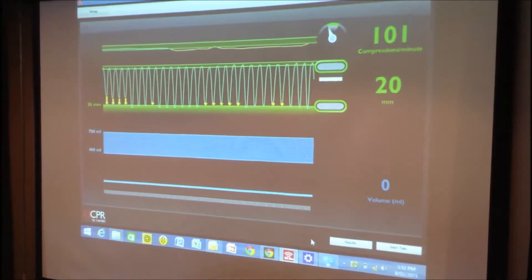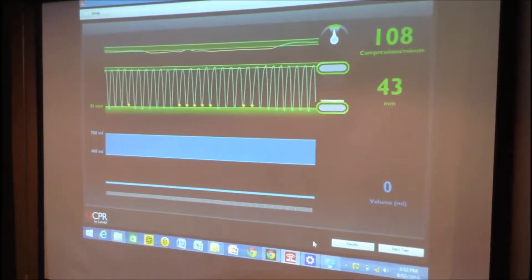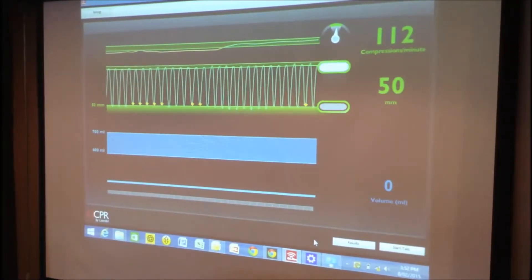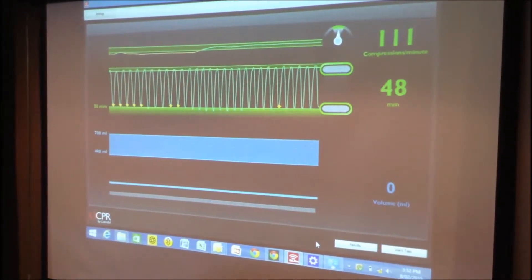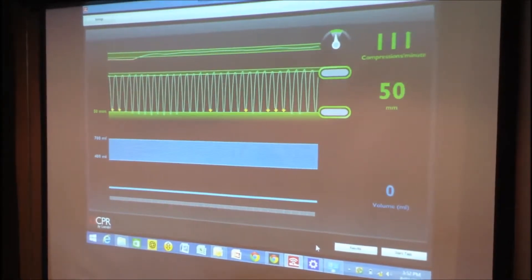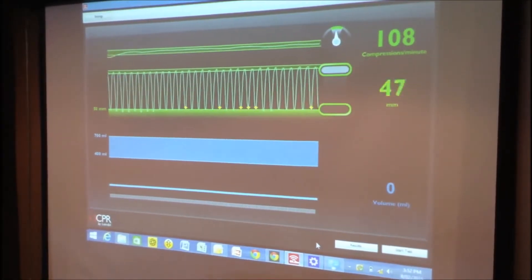So if I bring everything back on track again, it should all go green. It's very intuitive and this helps muscle memory in participants so that when it comes to performing CPR for real on a patient, they can rely on that muscle memory from having practiced using live feedback.